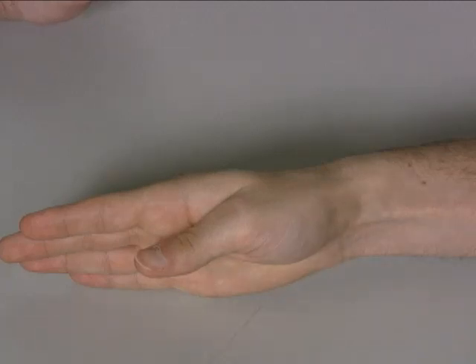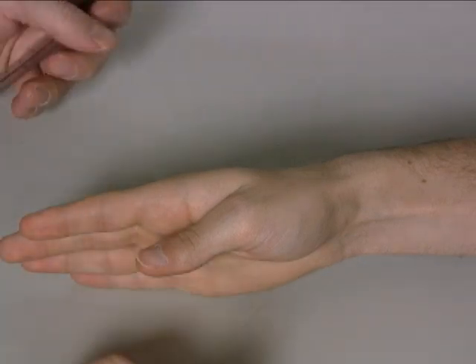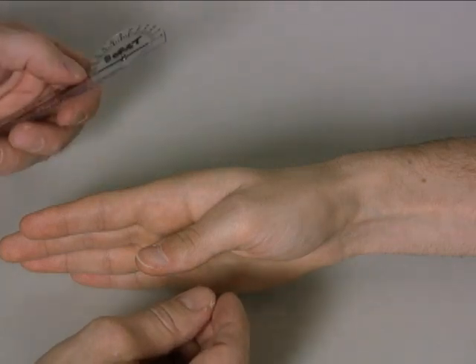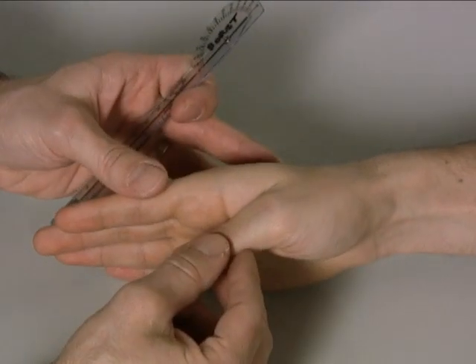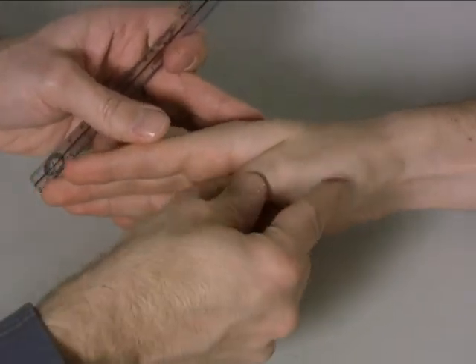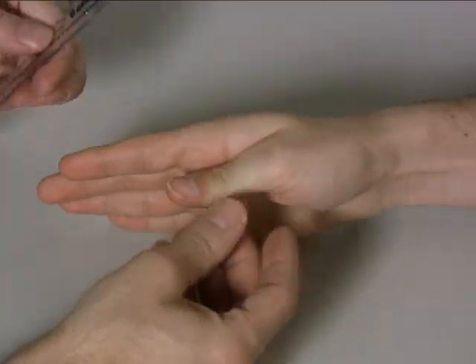To measure thumb carpometacarpal joint palmar adduction to palmar abduction, the starting position is with the hand on the ulnar side. The thumb is adducted to the palmar aspect of the hand.